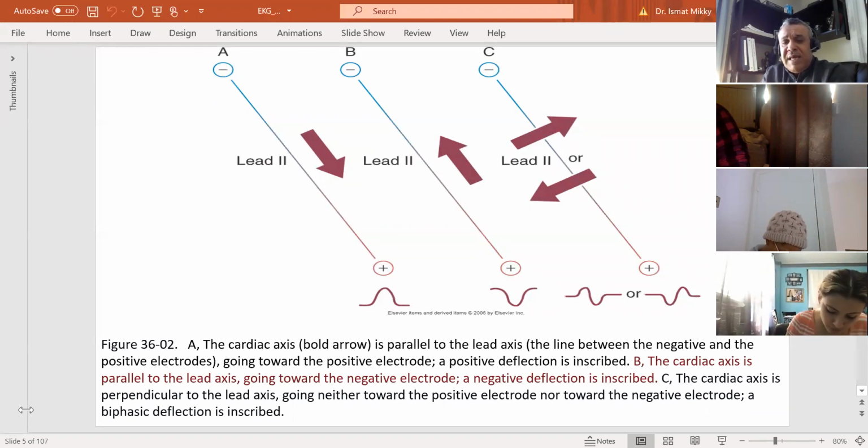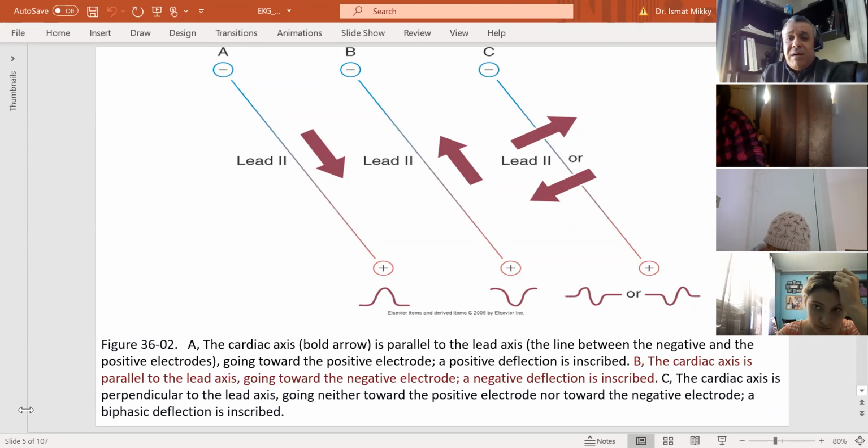First of all, just to get the basics of the EKG in terms of the device which provides us with these results on the strip. It's called an EKG strip, a piece of paper you run on the tele floor. Each patient is connected to a wireless device, and that monitor displays the EKG tracing.